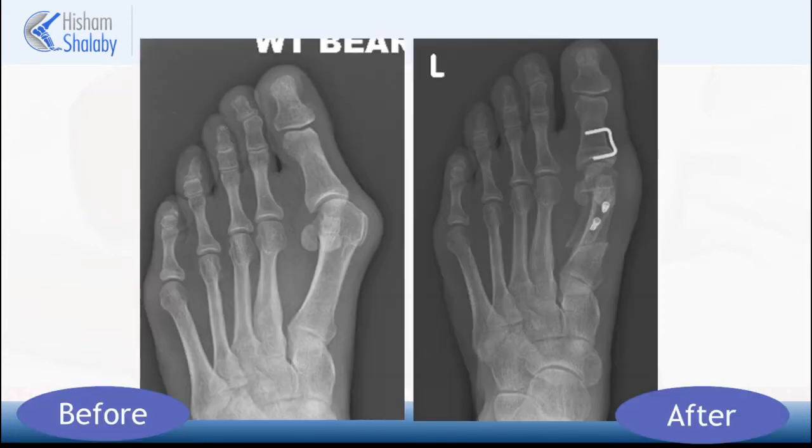This is fixed with a small staple which restores the overall alignment of the toe. Here we can see before and after x-rays of a severe hallux valgus or bunion deformity being corrected using this technique. This is currently the standard technique for correction of the bunion deformity in the majority of cases and it yields excellent results, allowing early mobilization following the procedure with full weight bearing without the need for any plaster casts.